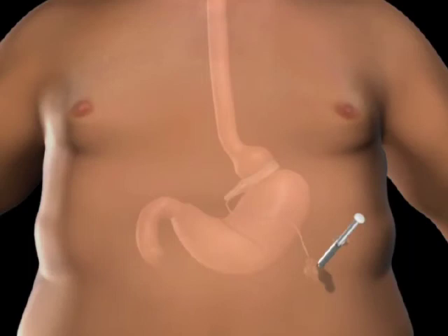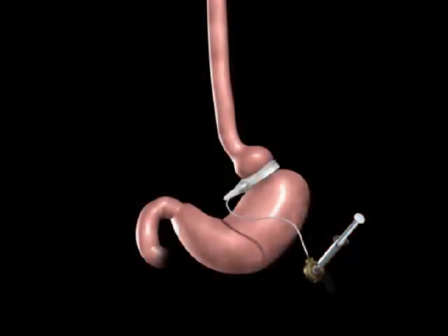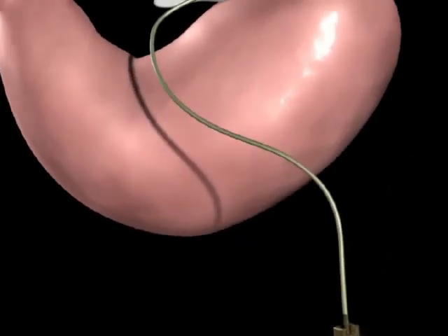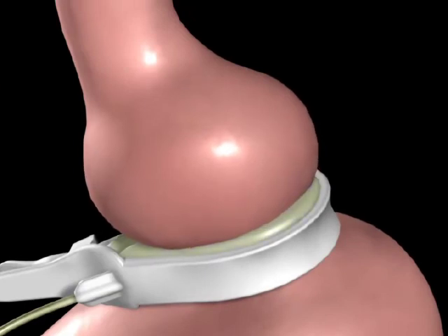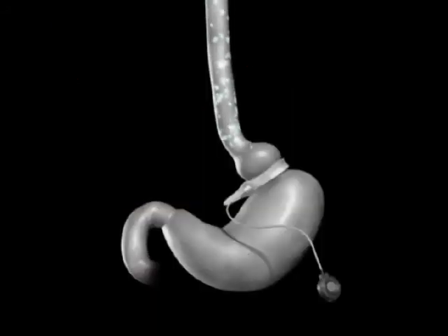A few weeks after the surgery, the band will be tightened by injecting saline into the injection port. As the saline is introduced into the port, it travels through the tube to the band. The addition of saline to the band creates a smaller upper stomach pouch, which restricts the amount of food you can eat before feeling full.